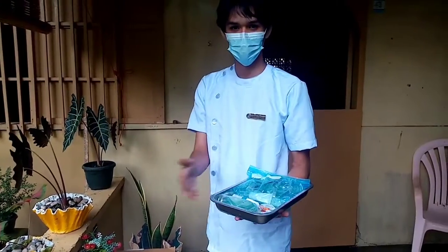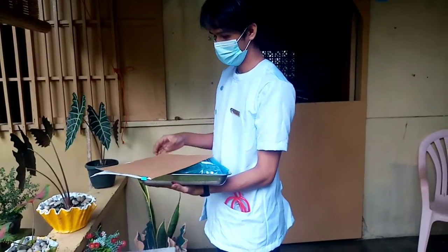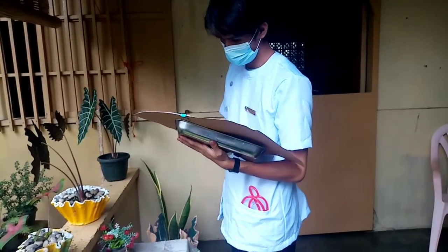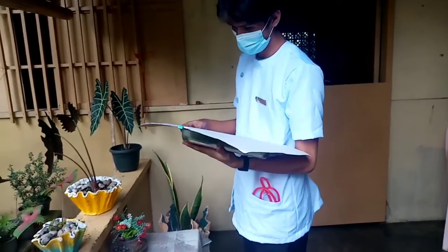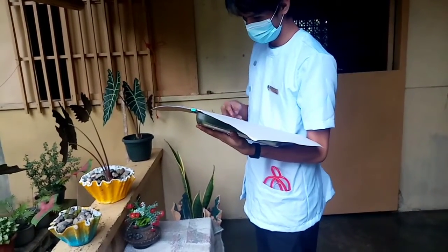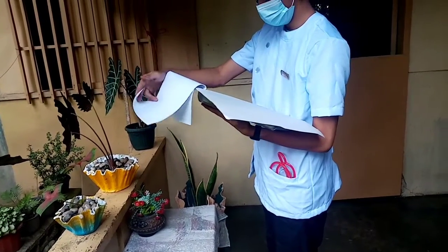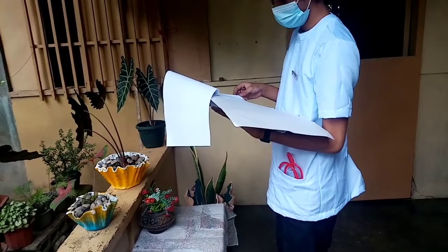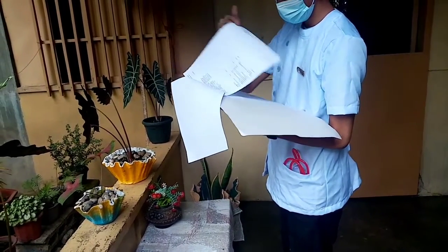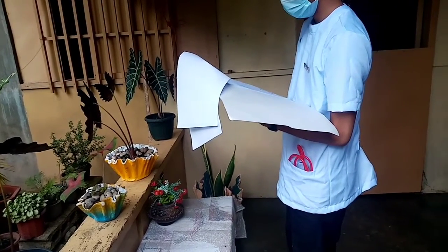Gather equipment. Check the medication order against the original physician's order according to agency policy. Clarify any inconsistencies. Check the patient's chart for allergies. Know the actions, special considerations, and safe dose range, purpose of administration, and adverse effects of the medication to be administered. Consider the appropriateness of the medication for this patient. Perform hand washing.